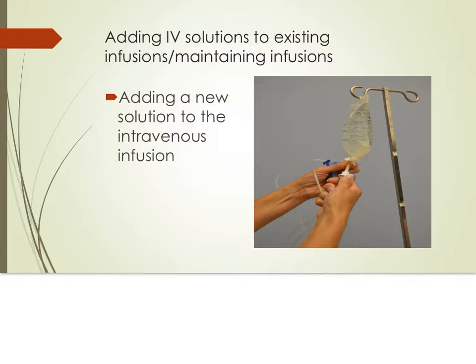When you're at the patient's bedside, you properly identify the patient. Inspect the IV site for signs of complications. If the IV site shows signs of infection or infiltration, the site should be changed before the new solution is added. Hang the IV container on the IV pole.